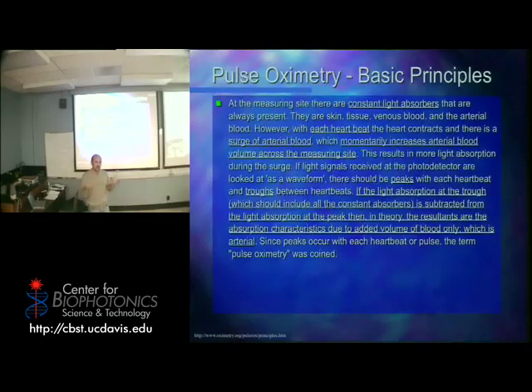Depending on certain procedures. But they had to figure this out because eventually they now end up using this in every single surgical procedure that's going on. They've got you monitored for the oxygenation. Was there a big push for this?